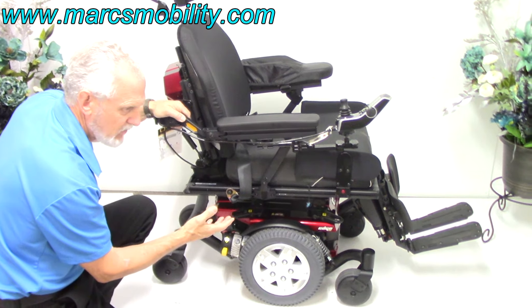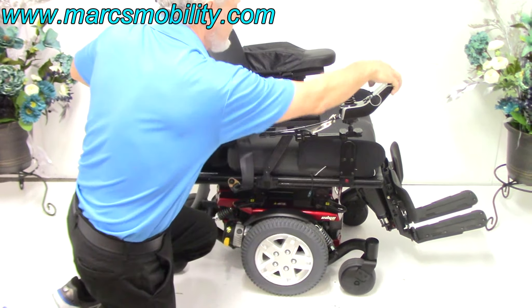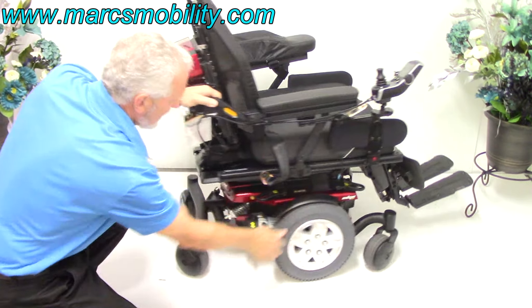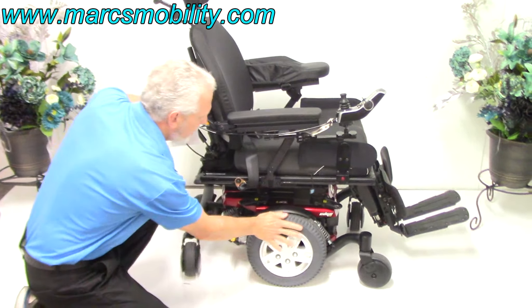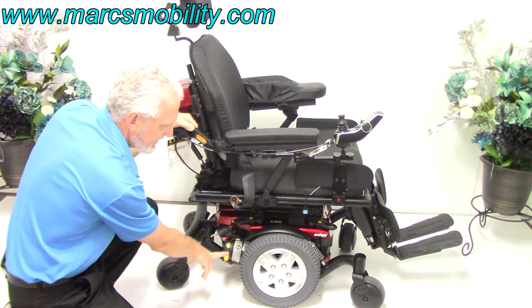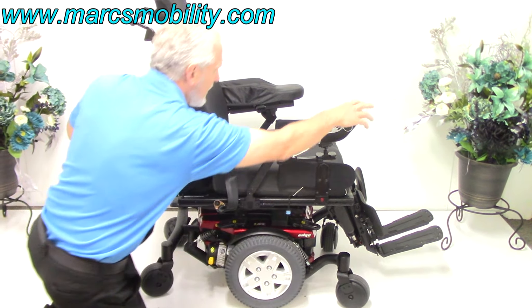Right now I can't roll this chair because it's in gear — it probably weighs right at 400 pounds. To roll it manually, turn the power off and push the handle down on both motors. That unlocks the motor. Once you put the handles back up, you can hear it go back into gear. Only use manual mode in an emergency, just like a car.